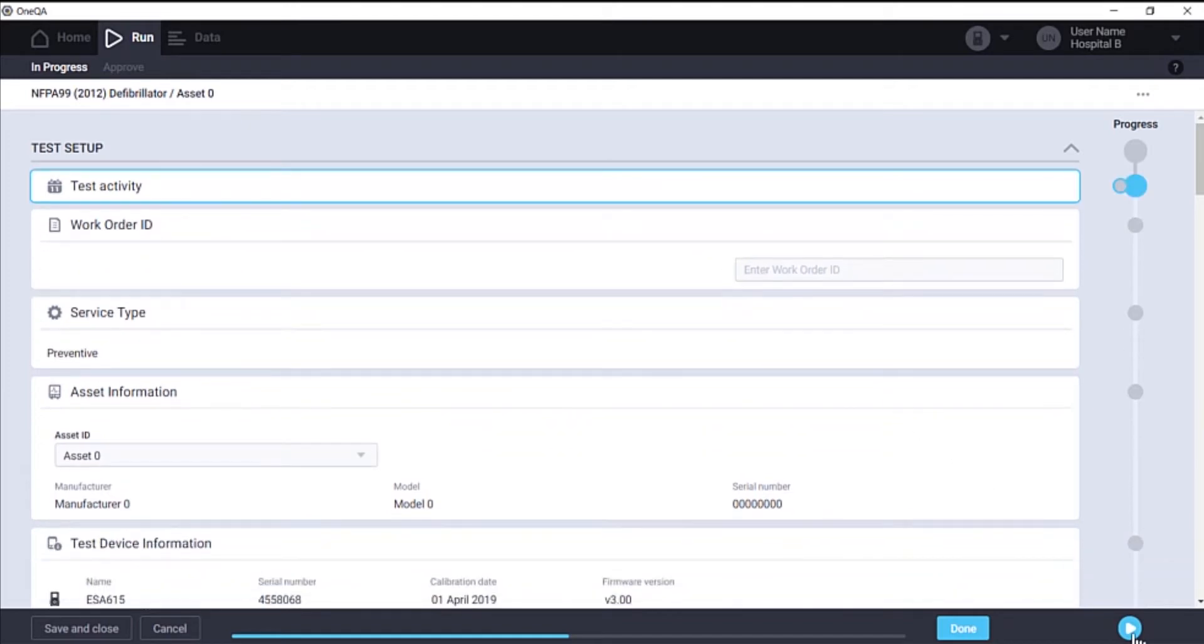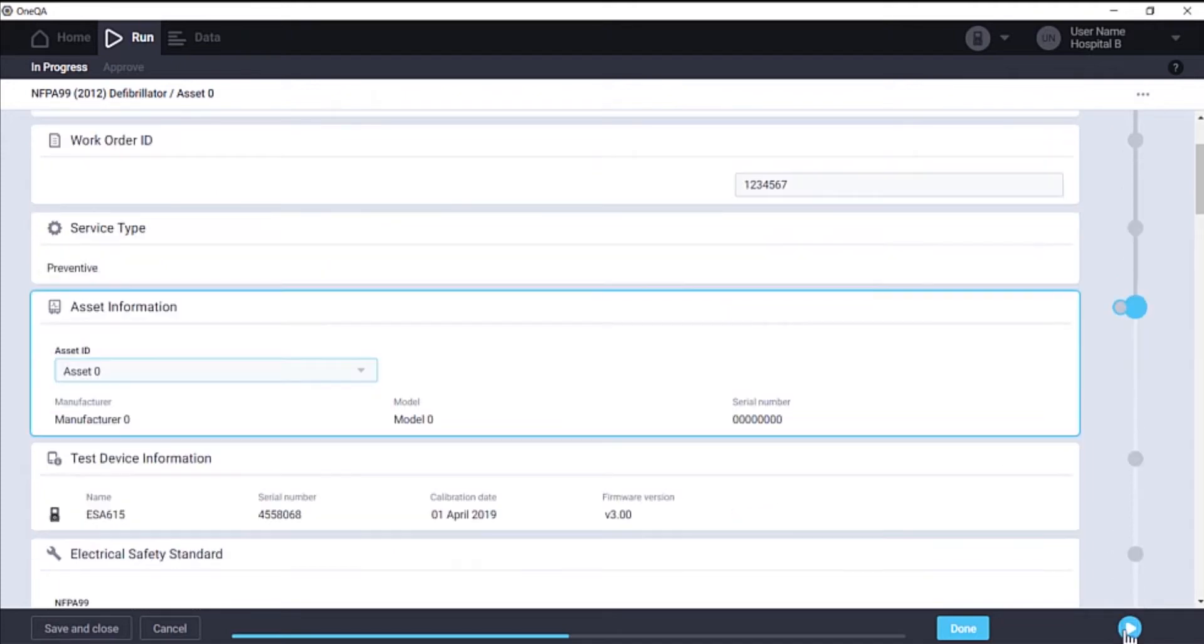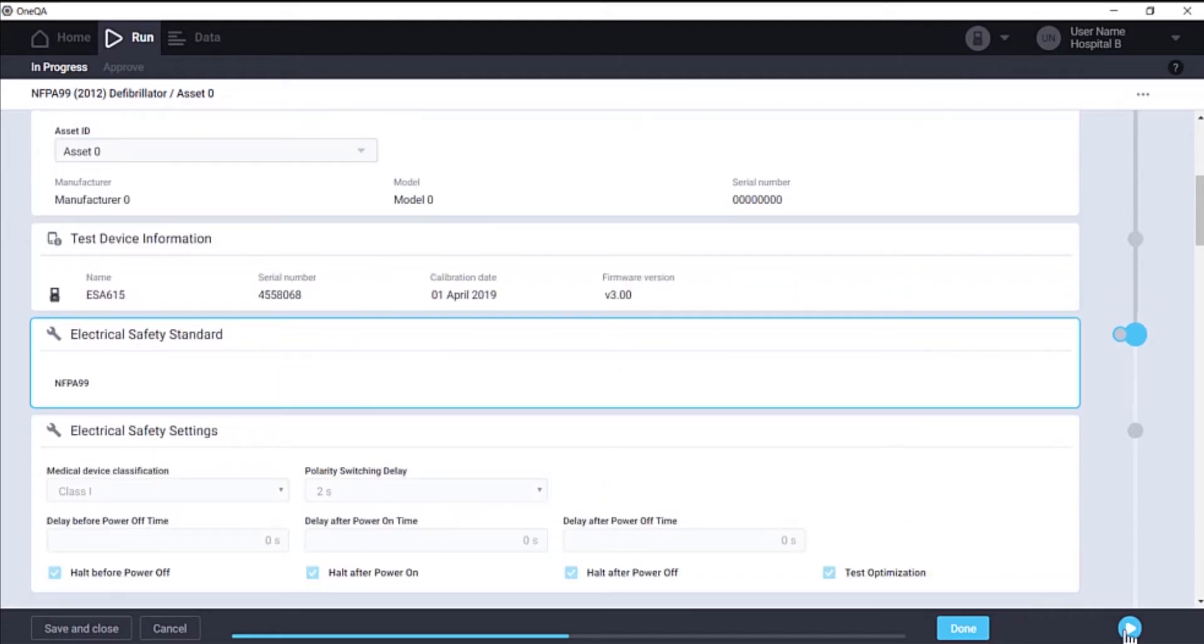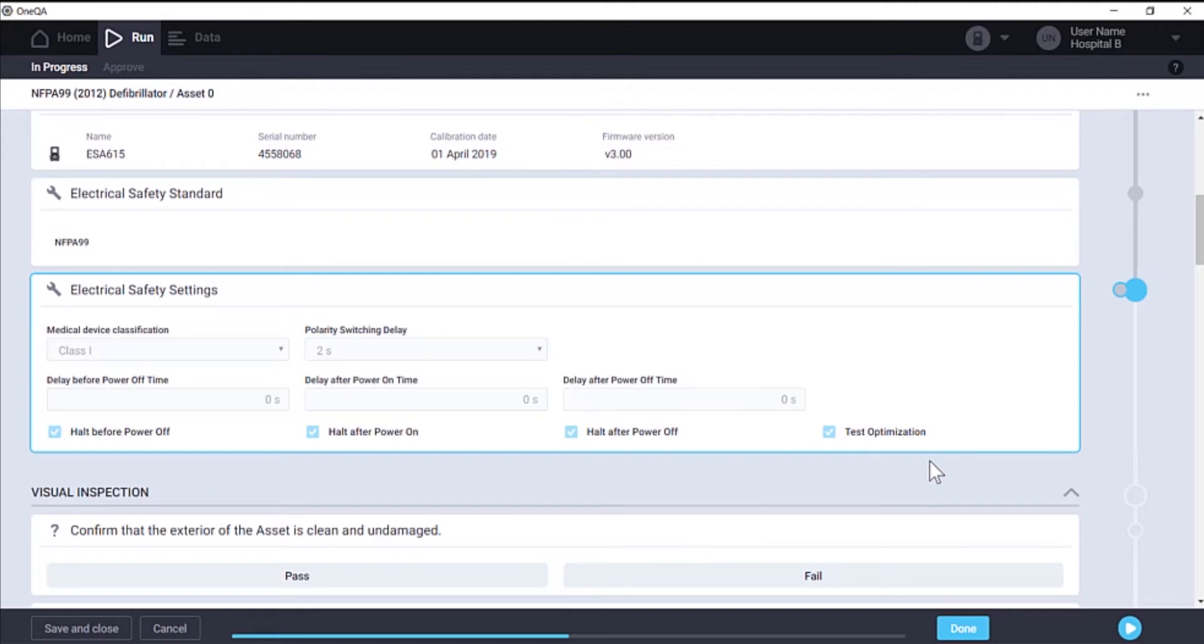We will step through various steps entering our work order ID, verifying this information is correct. Here you can see electrical safety settings such as test optimization, which optimizes the sequence of tests that will be performed for time savings.